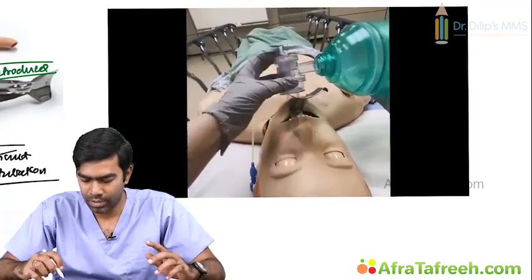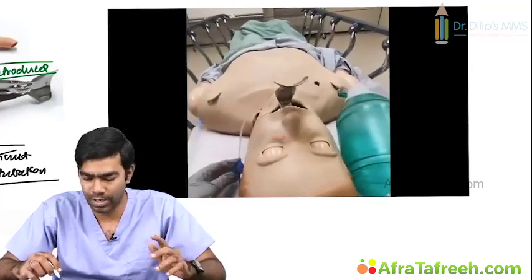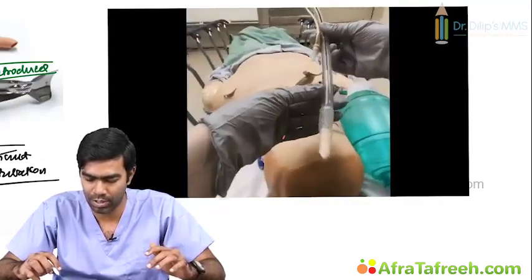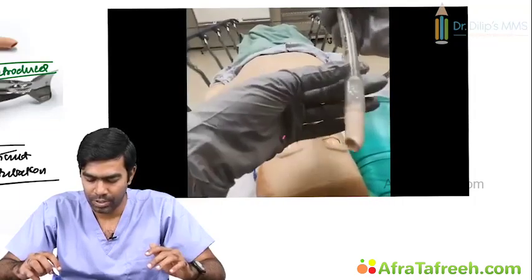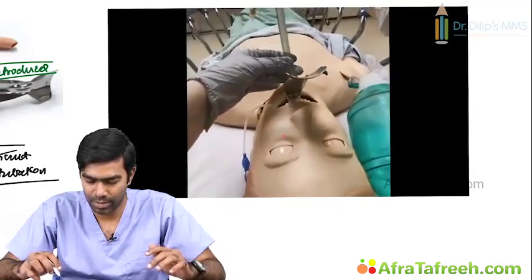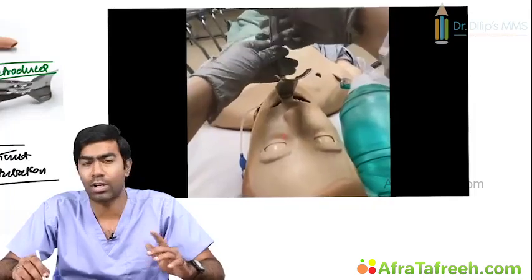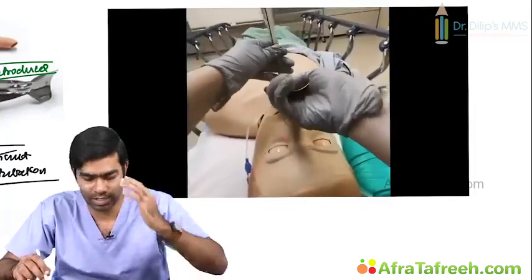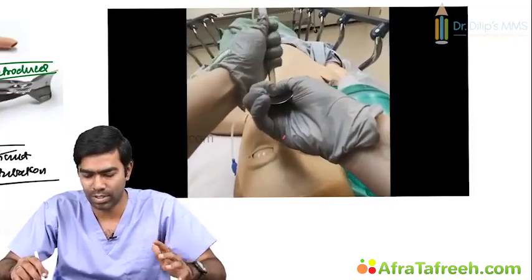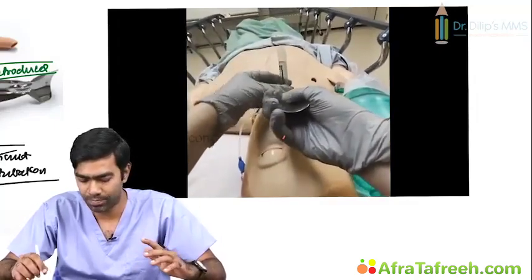for quite some time. So once you have finished ventilation, the primary idea of this fast track LMA or intubating LMA is to intubate the patient with an endotracheal tube. So you have this endotracheal tube that comes along with the packet. So you are going to insert this endotracheal tube into this LMA. Remember, one advantage of this intubating LMA is it can accommodate up to size 8 endotracheal tube. Other second generation LMAs cannot accommodate up to size 8 endotracheal tube, 6 to 7 with difficulty, but this can easily accommodate size 8 endotracheal tube.